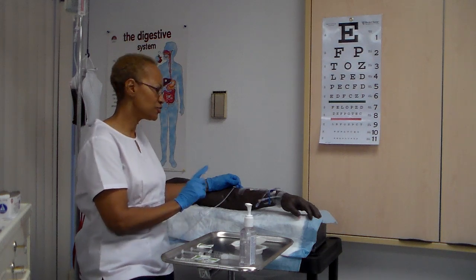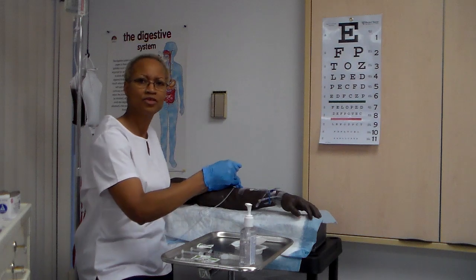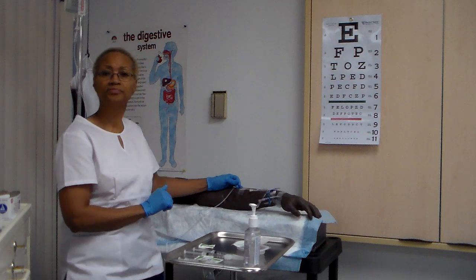So you can give a little bit and then wait, give a little bit and wait, because that's an irritating drug. As it goes in, they're going to say, ooh, that burns. Okay, what if you stood there and you flushed it in all at one time? If it's an irritating drug, then what it's going to do is blow your line. Okay, and you don't want to do that, or you're going to be constantly starting new IVs.